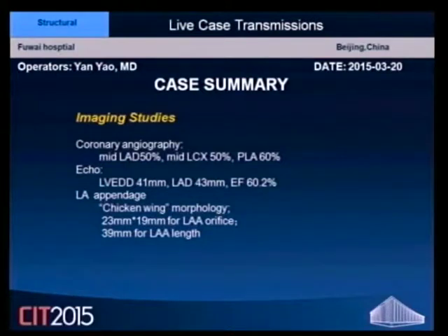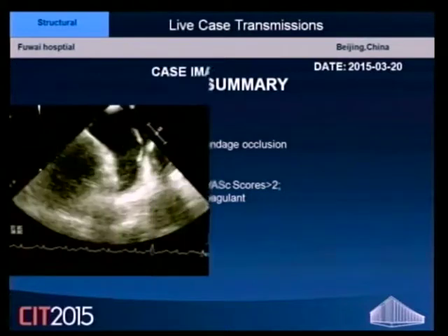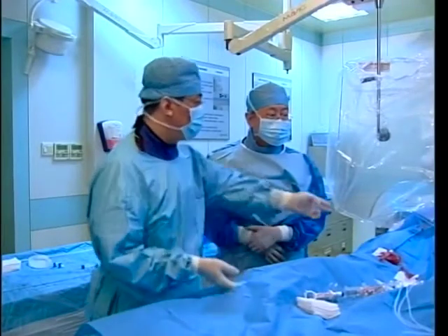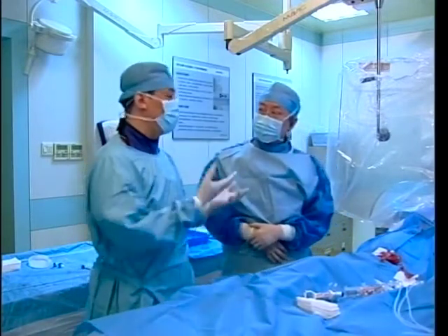The way we do this is, Dr. Park actually wants to show the unique advantage of this series of LAmbre, which can be used for transseptal puncture also, but which requires general anesthesia. Unfortunately, my hospital is too busy, and we usually perform such left appendage closure without general anesthesia. So we just do it with lidocaine injection locally. So we cannot perform that way.